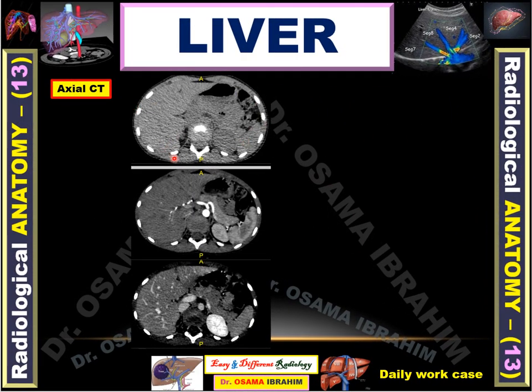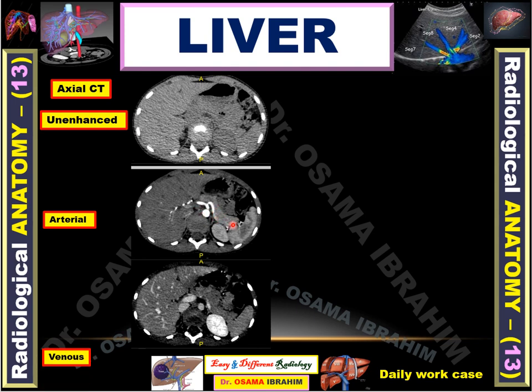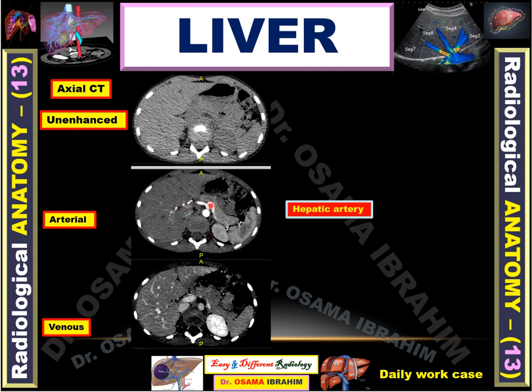This is axial CT imaging in different phases of the liver. The first phase is unenhanced CT — there is no contrast opacification of the aorta or inferior vena cava. The second one shows opacification of the aorta, so this is the arterial phase. The third one shows opacification of the portal vein and IVC, so this is the venous phase. These three phases can diagnose liver lesions, as the hepatic artery appears in the arterial phase. In the venous phase, the liver parenchyma is opacified by many vessels representing the portal vein and hepatic veins.